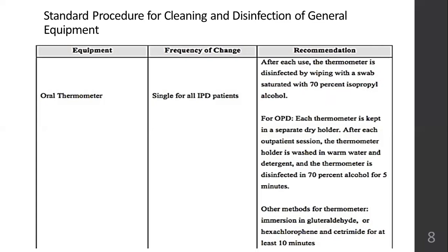Then standard procedures for cleaning and disinfection of general equipment that you use for general patient care. Okay, not specific patient care, like thermometer. For various patients, you will use it throughout a day, right? So one single thermometer for all inpatients should be used. After each use, the thermometer has to be disinfected. Okay. Only after disinfection, it has to be used by another patient.